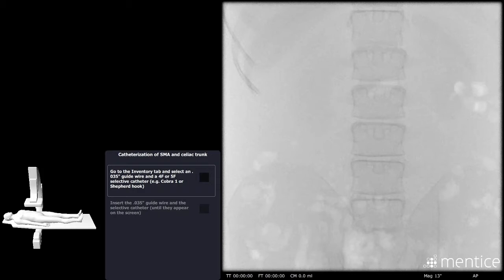So on your celiac trunk, you need to know where, for example, you could map out where your common hepatic arteries are, where your right gastric is, and also where your GDA is in relation to possible embolic point, and also potentially your cystic artery. So as you can see, before I've even reached the patient or started anything, there's a lot of pre-procedural planning that can happen for these procedures. When you come to deciding about the TACE, other important things would be things like Child-Pugh score, would also be important in determining what treatment you're going to do.